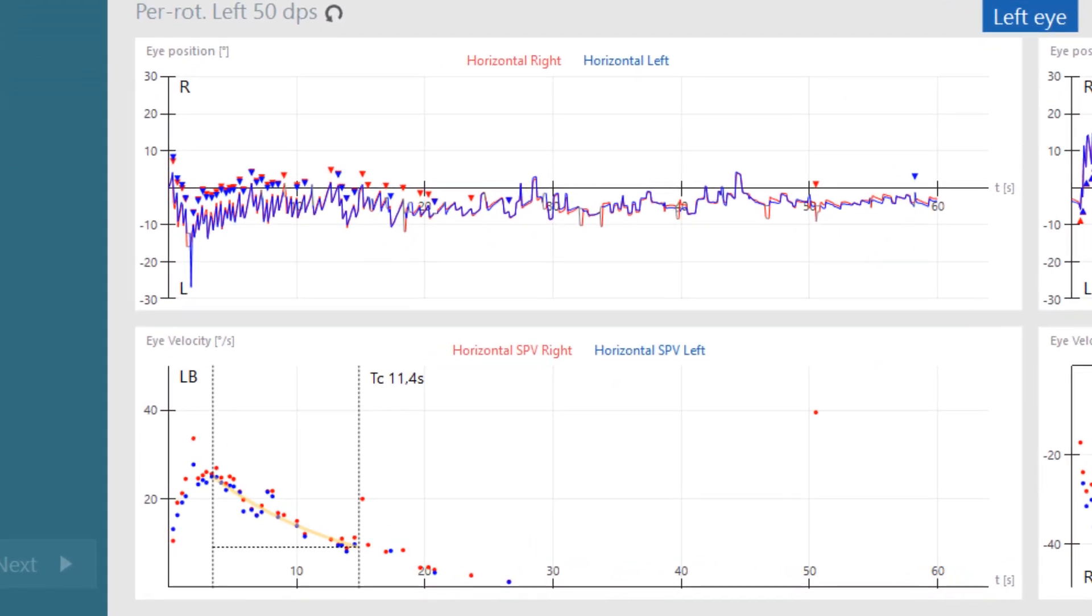While the acceleration occurs, nystagmus is measured. The peak slow phase velocity is recorded and the time constant is measured. The time constant is the amount of time it takes for the nystagmus to reduce by 63 percent, or to 37 percent of that peak slow phase velocity.